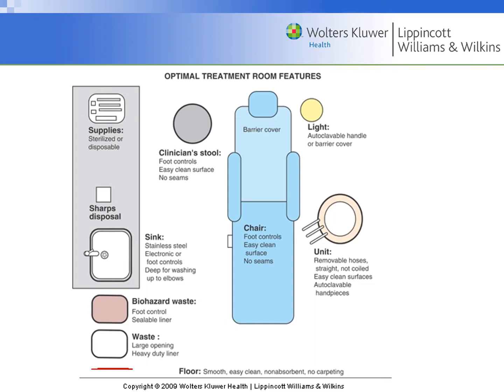So if you have a piece of gauze that's saturated with blood, you don't want to just throw that in the wastebasket. That is considered a biohazard, and it goes in a biohazard waste. At our clinic, we have biohazard bags, and they are kind of a reddish color with the biohazard sign on them. We have one hanging up in each op for you to be able to drop things in there. So you don't use the biohazard bag for anything but biohazard materials.